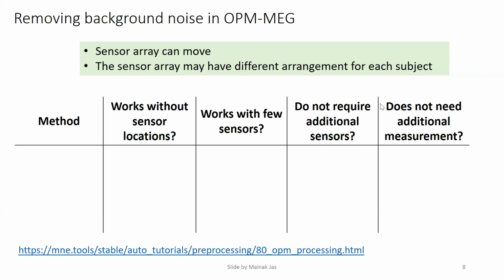While we were analyzing the data for our experiments, I decided to list some of the considerations we had in mind when choosing the method. It's still somewhat of an ongoing process, but I'm trying to show how we are thinking from the user perspective. So we have certain criteria.